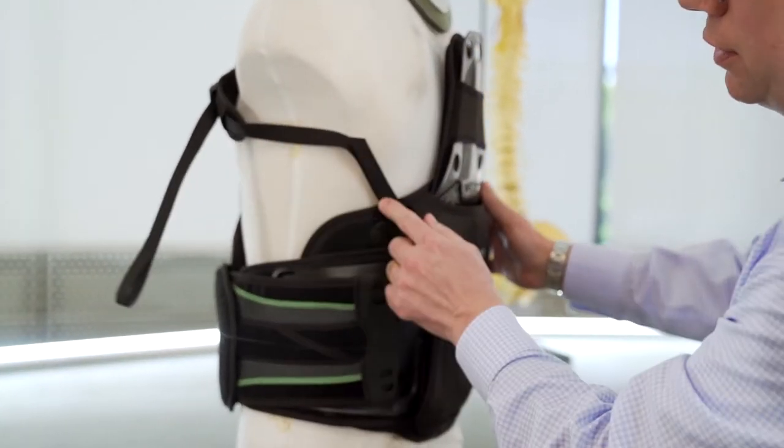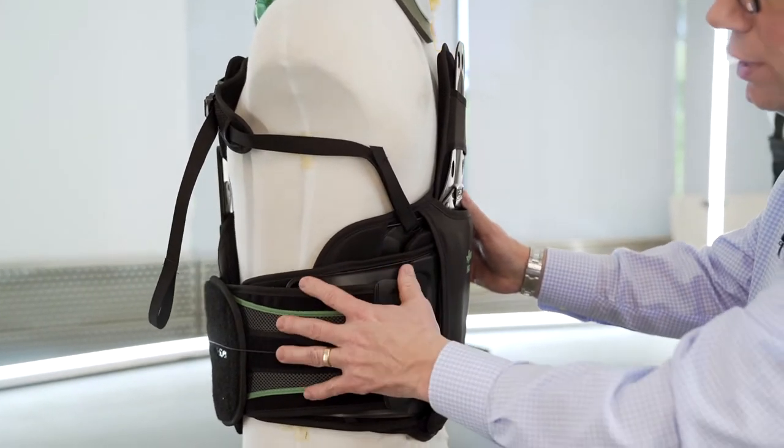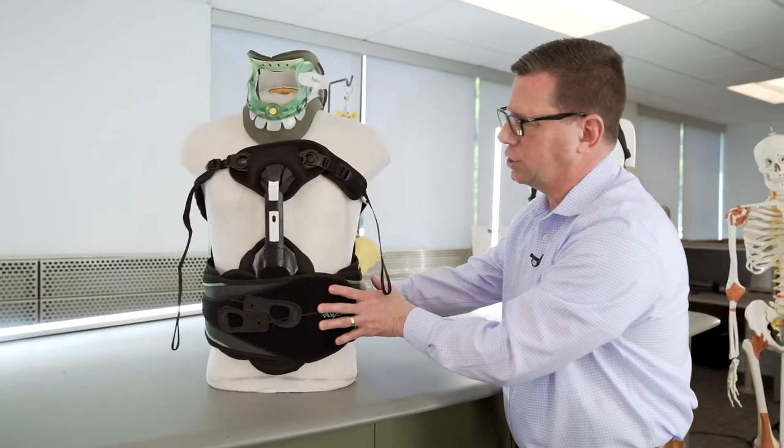These straps can typically go underneath the arm but may go over the shoulder depending on the preference of the practitioner or individual patient conditions or issues.